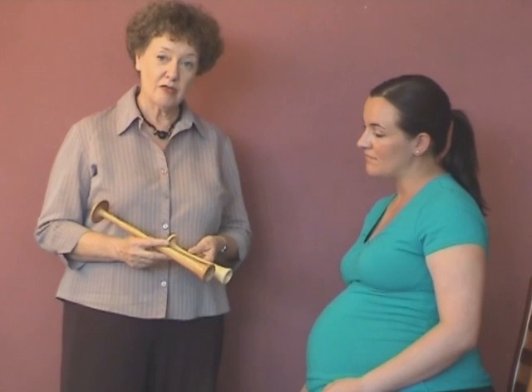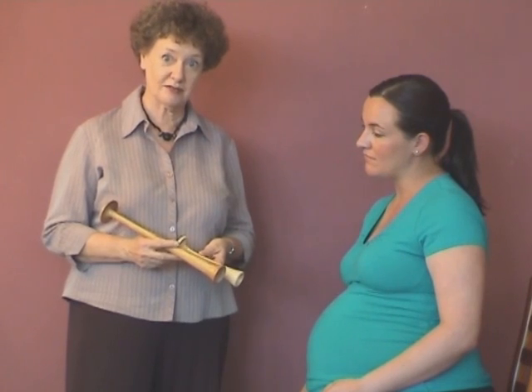By using a Pinard stethoscope, it means too that the baby is not going to be exposed to perhaps long periods of ultrasound that would happen if there was a CTG machine used or a Doppler stethoscope was used.